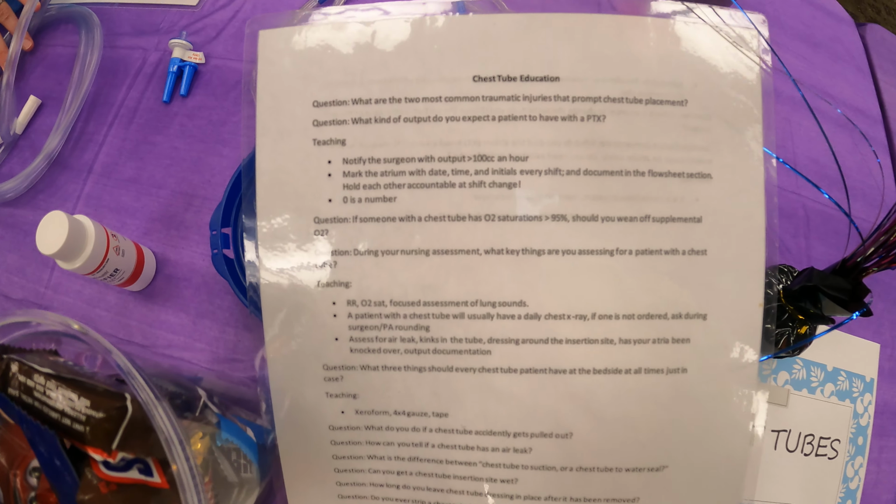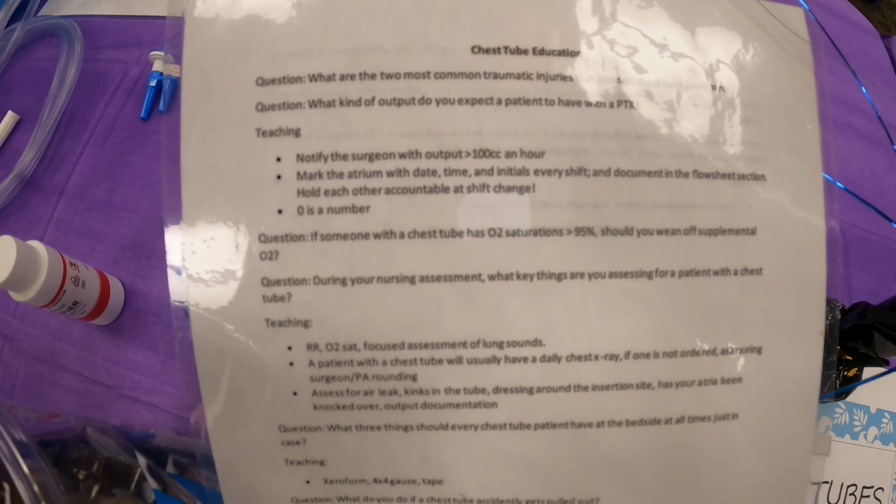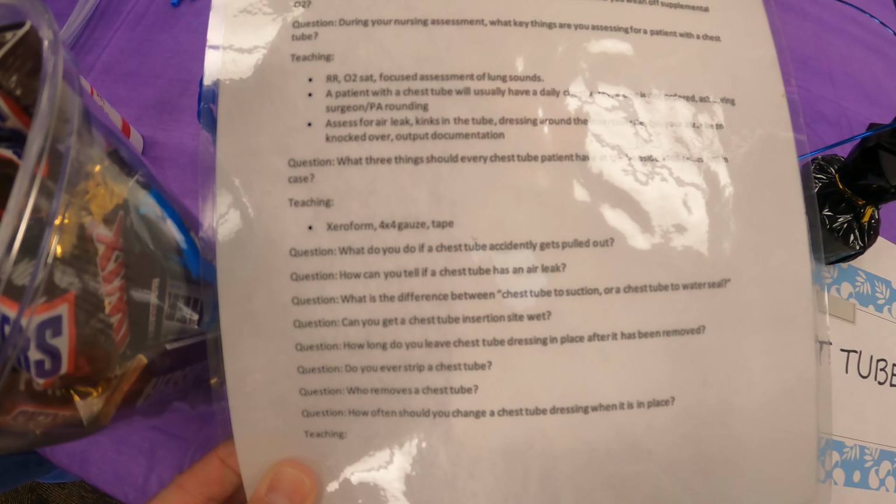When they're hooked up to suction, we already talked about that. They can walk around the room. Right. When they're hooked up to water seal, they can walk around.